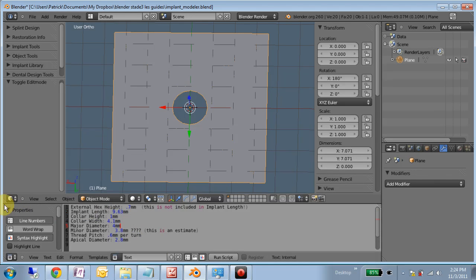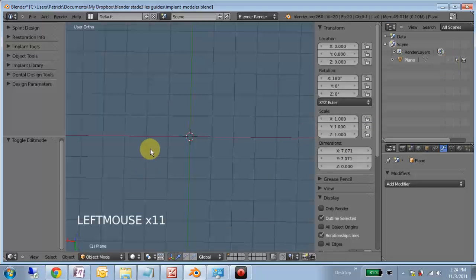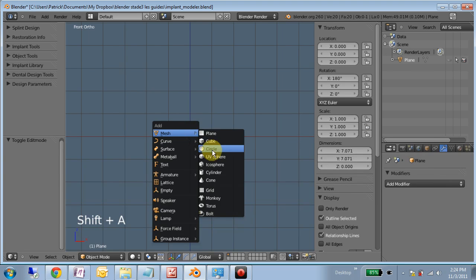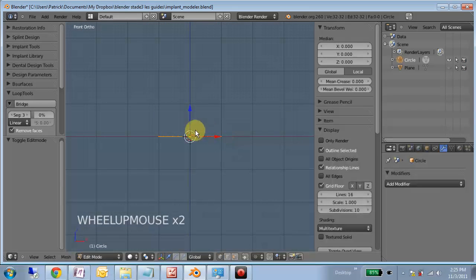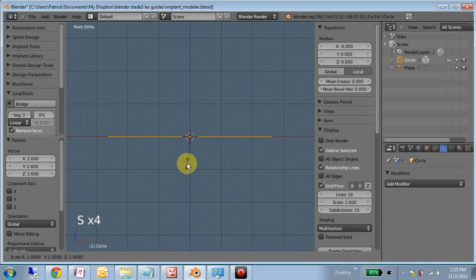So let's get started. I'm going to hide this. I'm going to hide the plane. We're going to look at this from the side. And there are multiple ways to do this, but for now we'll just start with a circle. We'll tab into edit mode. And I'm going to let this be the apical cylinder, so we'll scale by 2.6 and then scale by 0.5.